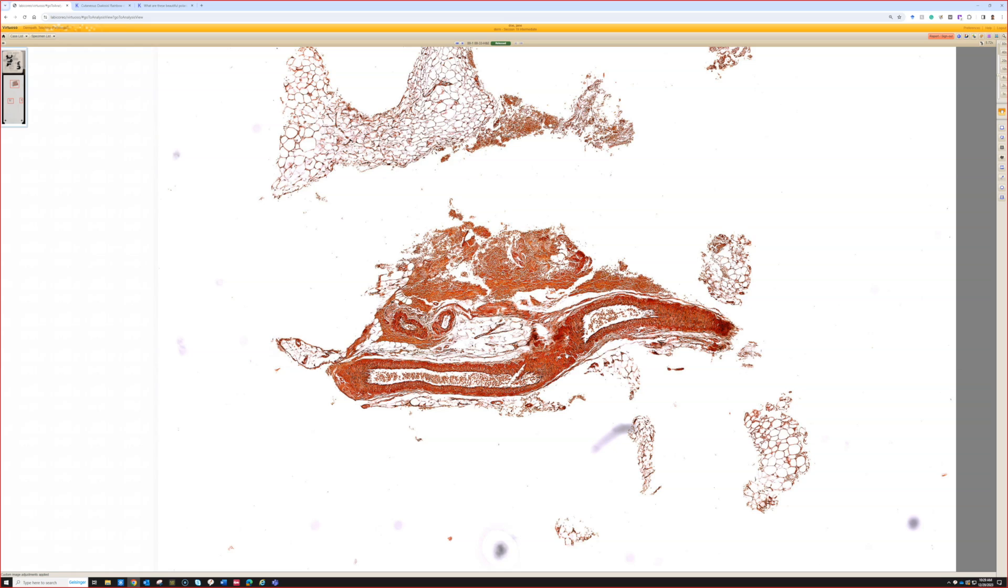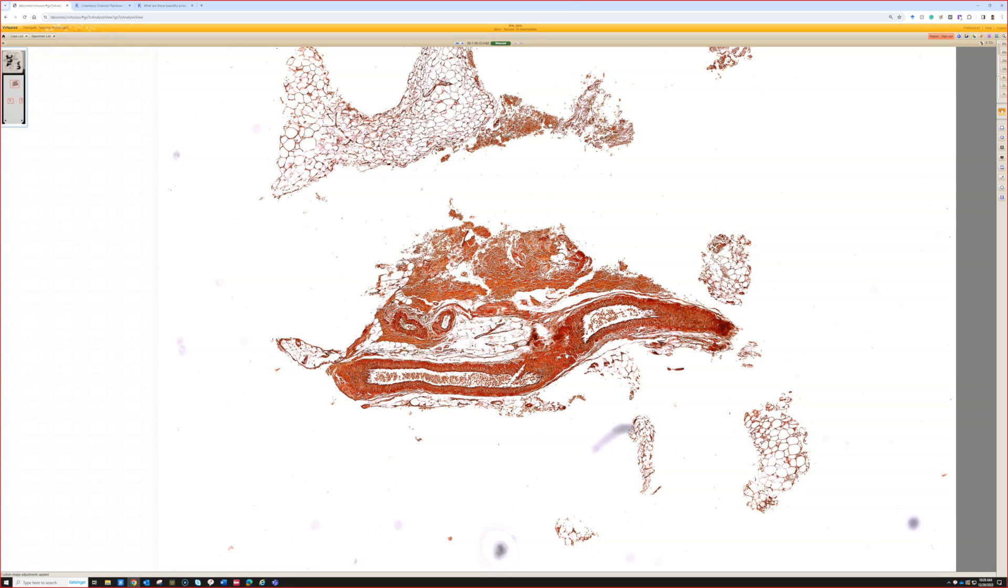So it's insulin-type amyloid. That's from chronic insulin injection in the same areas of the abdomen, and some of that insulin accumulates and deposits protein. If you do mass spec on that, they will actually show that it's insulin-type amyloid rather than light chain amyloid.